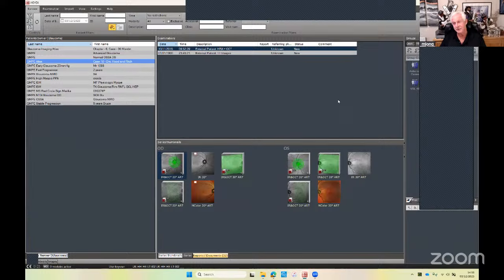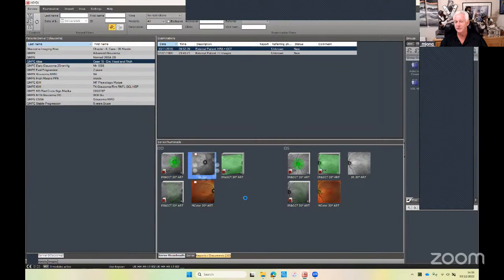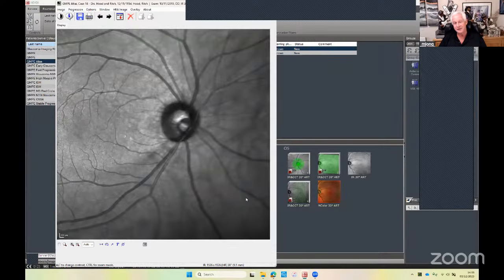Let's start with a classic glaucoma case, just to get you into the mood and show you that this is a regular process. Every single eye, I look exactly the same way. I can actually extract the fundus image from the OCT here, and this is very useful. Often I get sent cases to review from an OCT perspective, and I haven't seen the patient.